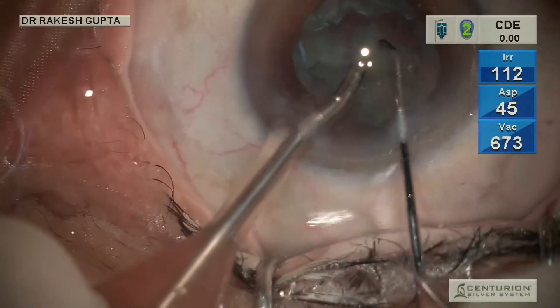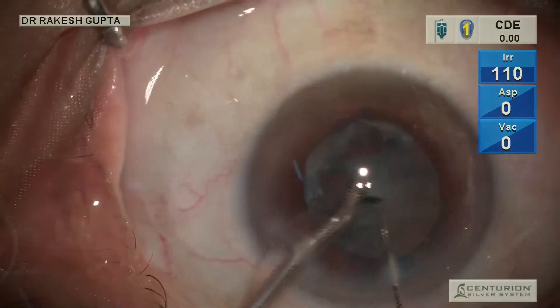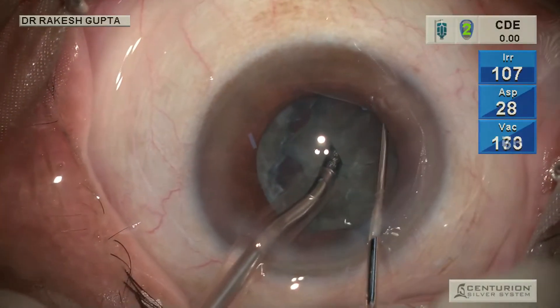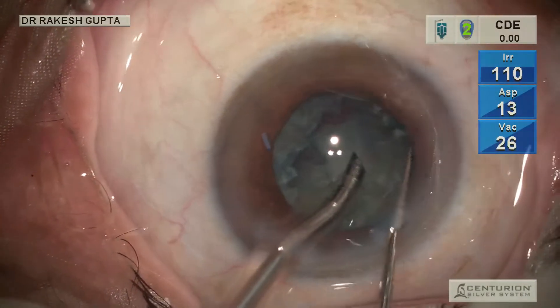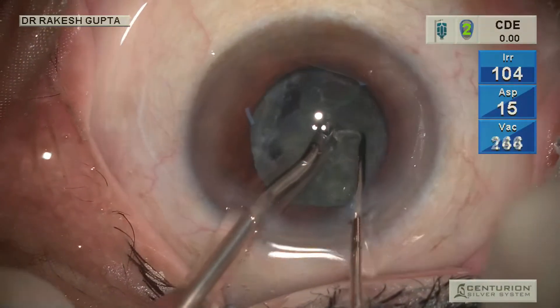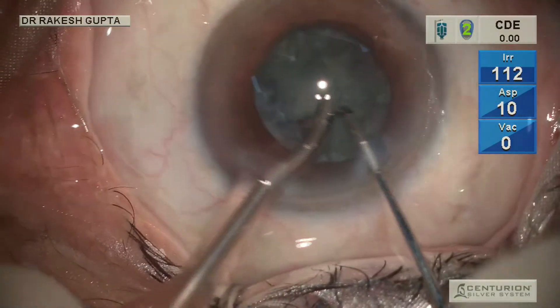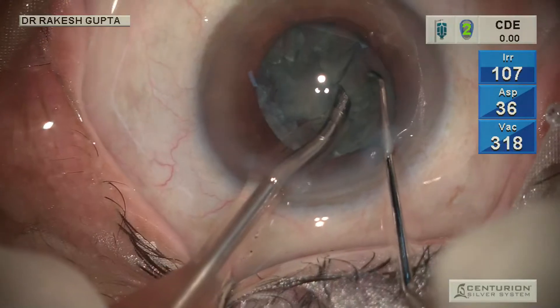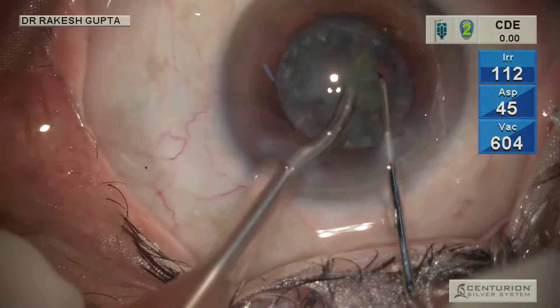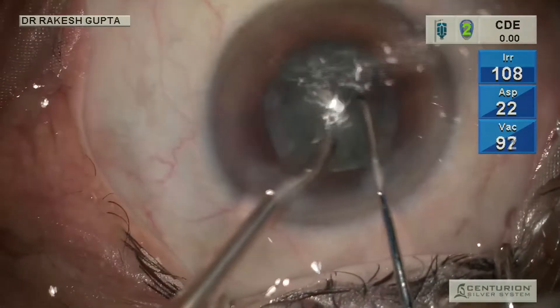Let me briefly explain this chopper. It is made of steel, with a long tip at the end that is bulbous. There is an angle between the shaft and the tip of the chopper which is not 90 degrees as with most choppers — this angle is around 110 degrees. This creates a slant on the tip so that when you go to the periphery for chopping up to the equator of the nucleus, there is no risk of damaging the capsulotomy edge, and the thick tip ensures no perforation of the posterior capsule.